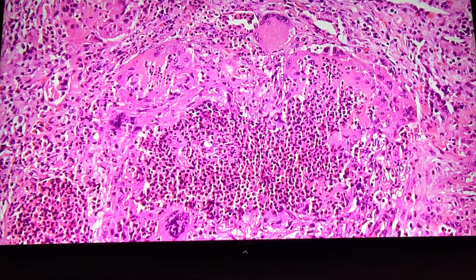Mycobacteria, less. Histoplasma? No, actually, histoplasma has pink necrosis usually, not suppurative, not neutrophil rich. Cat scratch in the lymph node would be right, but not in the lung. Blastomycosis has classically suppurative granuloma. It's of the fungal organisms. If you see this, bang, you know that it's most likely blastomycosis. Wegener's is another thing that does it. Okay, so go one low mag.